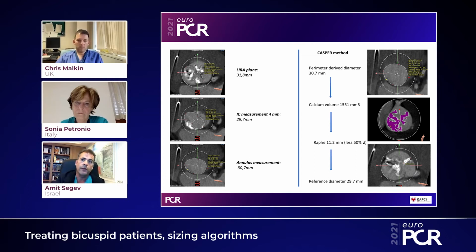You have to implant at 0 in the annulus and try to implant as much as you can supraannulary in order for the valve to accommodate the minimal diameter, which is 4. Sometimes it's even more than 4. Sometimes the minimal diameter is actually at 8 millimeters above the valve.